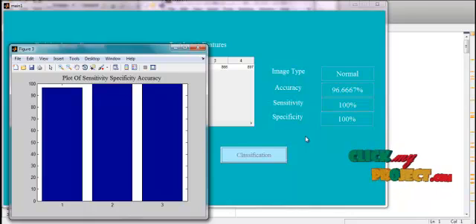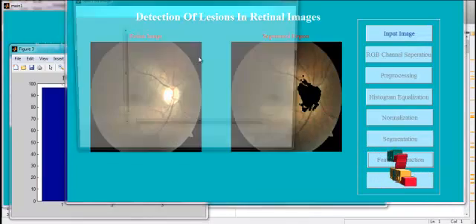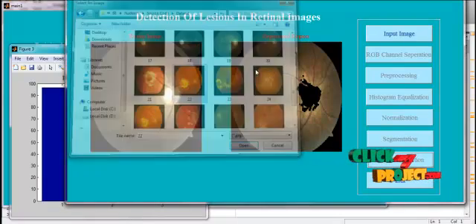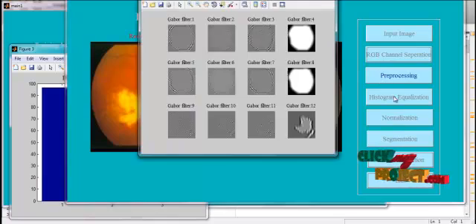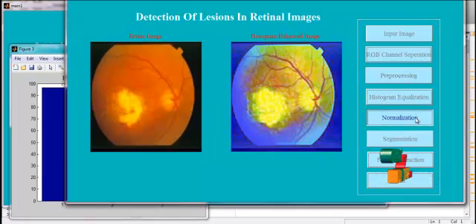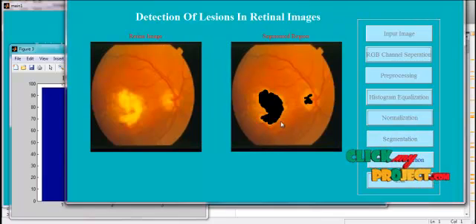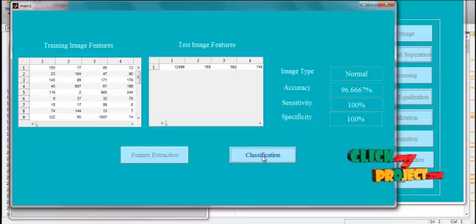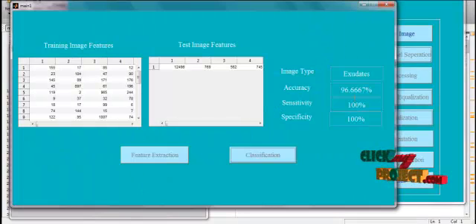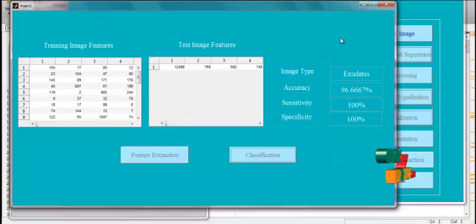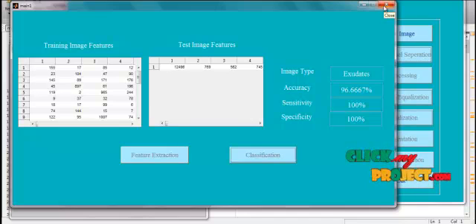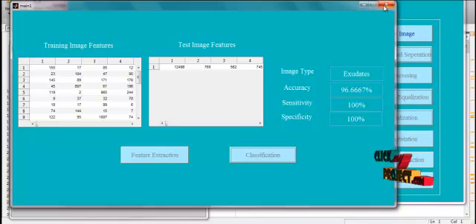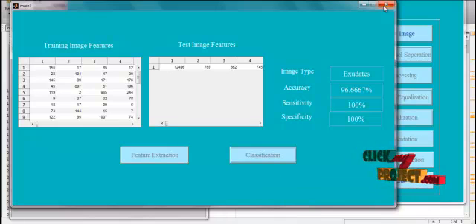Similarly, we can also classify other images. For example, if we give a micro-aneurysm image, we perform the same process — segmenting the particular regions, extracting the features from the images, and then classifying. Here we are segmenting and identifying the exudates. We have given four categories: exudates, micro-aneurysm, hemorrhages, and normal images. That is how we do the process.